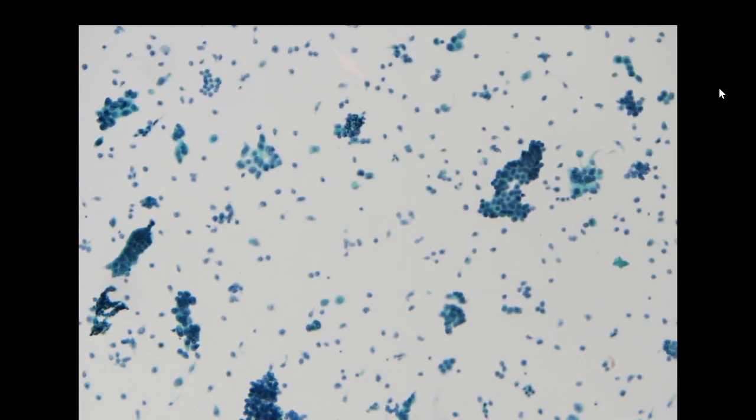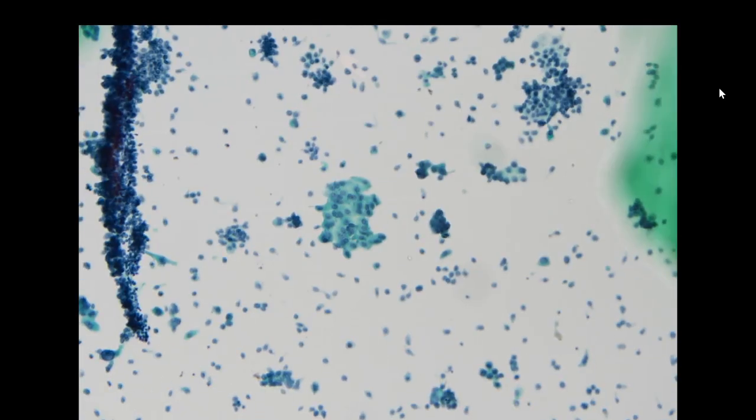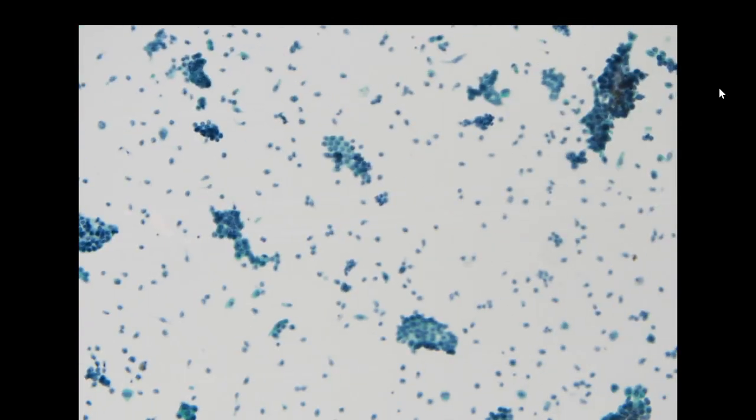But this cytology specimen is classic for low-grade urothelial neoplasm because we have the papilla. And the background morphological pattern is very classic for a low-grade urothelial neoplasm, which includes PUNLMP and low-grade urothelial carcinoma, sometimes papilloma as well.